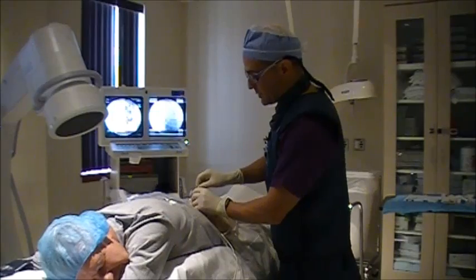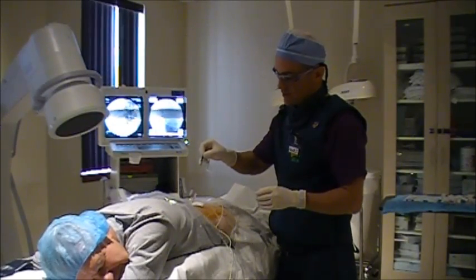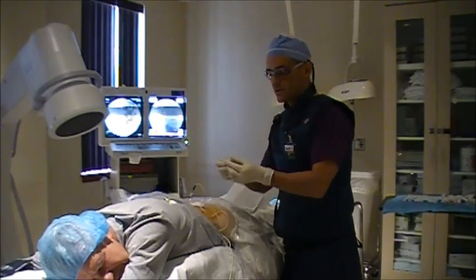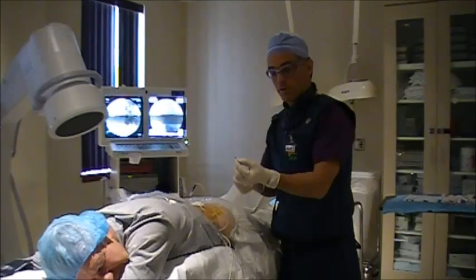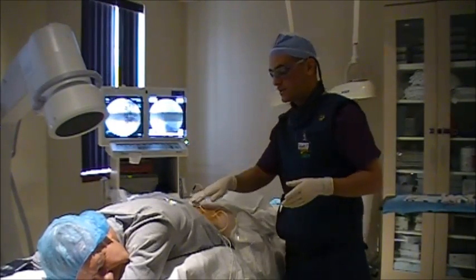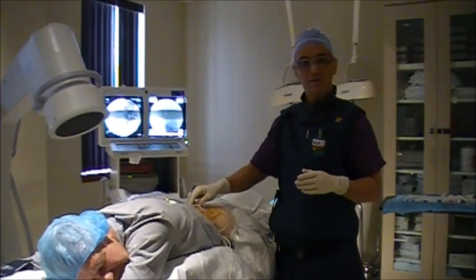sufficient. And we'll just take the stylet out. Go to the next one here. Situate it. Take the other needle out. You can still feel that the tip is somewhat warm when you touch it. And the last one right now is on. And we'll be done with this treatment in about 53 seconds.